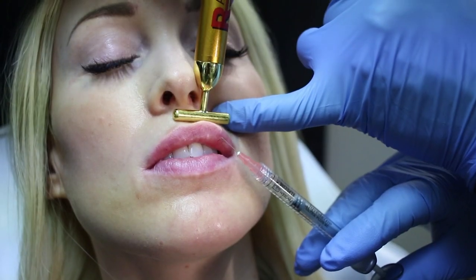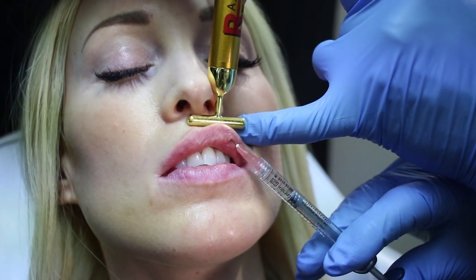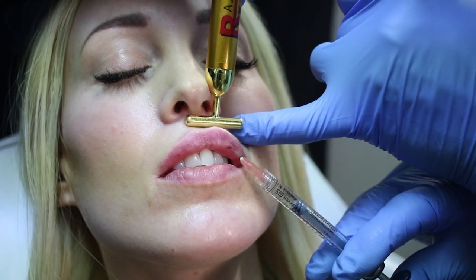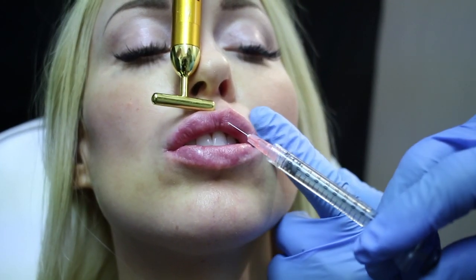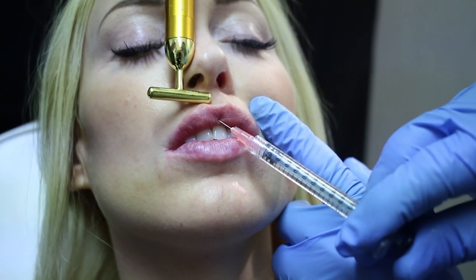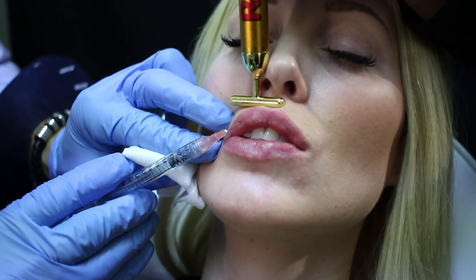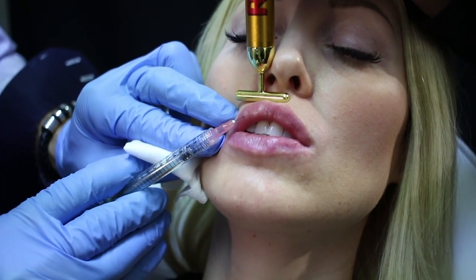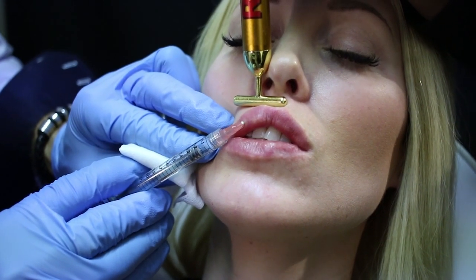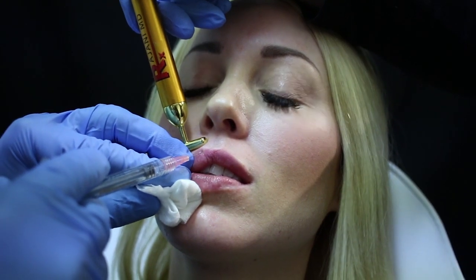What I do is address the border of the lip first, then the body — depending on whether there are vertical lip lines or the patient describes lipstick bleeding into the lips, which is common even starting at age 30 or so. Then I address the center of the cupid's bow. Here I like to use a vibratory anesthetic device along with the topical, as we move towards the center of the lip, which is more and more sensitive because those sensory nerve fibers converge.